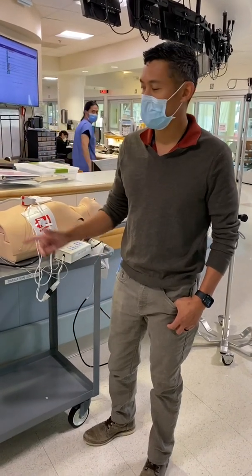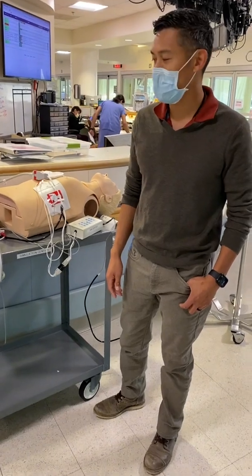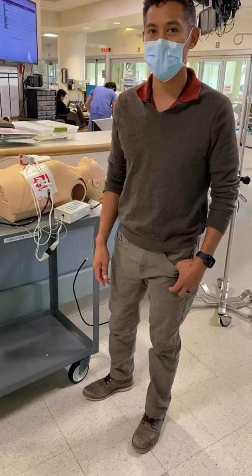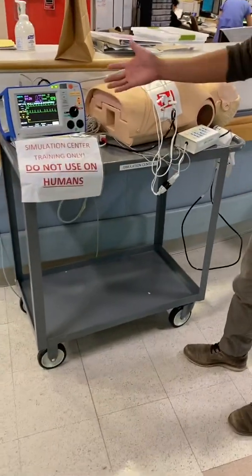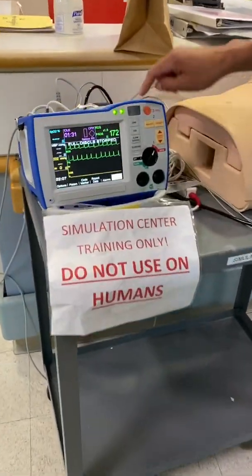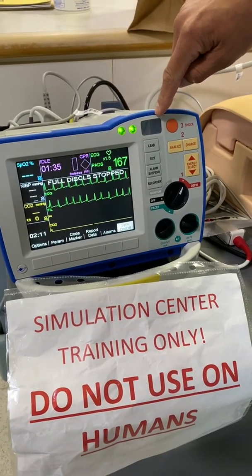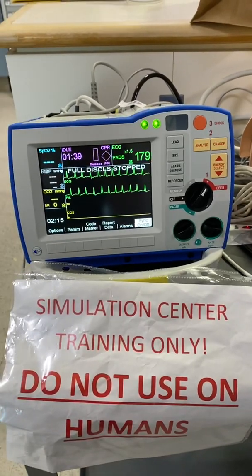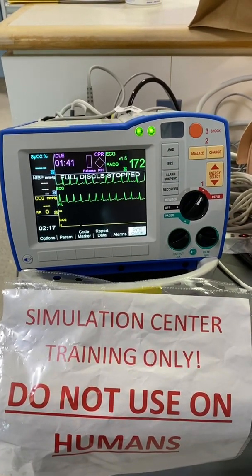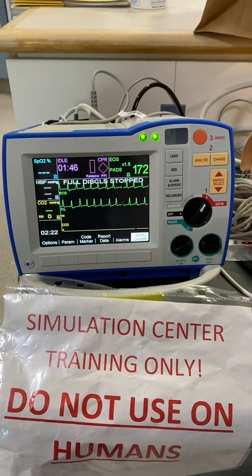Hey everyone, I'm Jonathan. I'm going to go through the Zoll defibrillator, using it in all of the manual modes and some of the troubleshooting things I want people to be familiar with. First, we make sure that it's plugged in or the battery is activated. We have our check mark indicating it's good for use. Right now I have it hooked up to the simulator with an arrhythmia — heart rate 160s, 170s, afib with RVR.